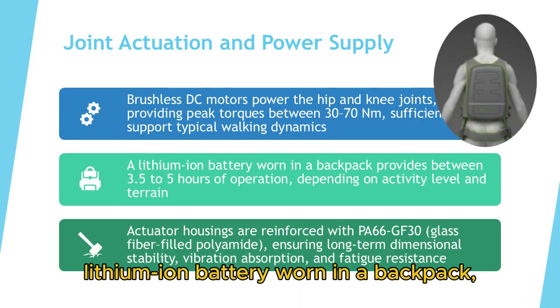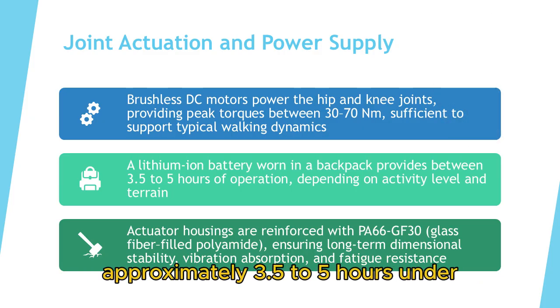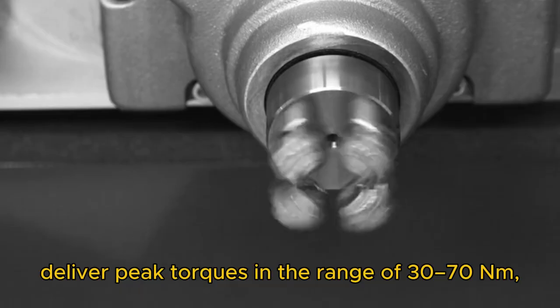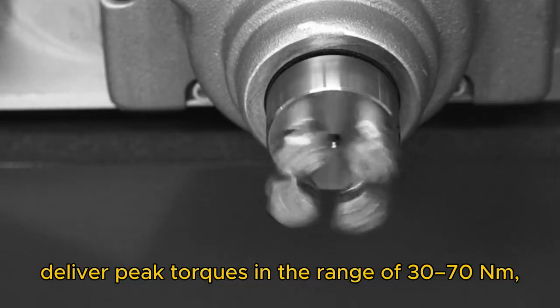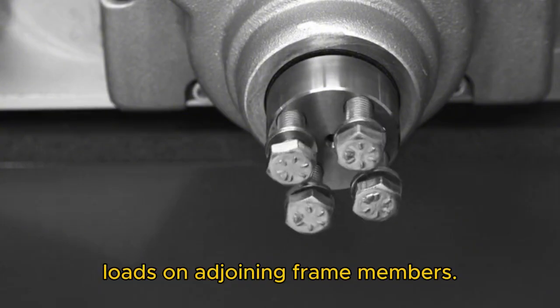Power is supplied by a lithium-ion battery worn in a backpack, with an operational duration of approximately 3.5 to 5 hours under typical usage conditions. The hip and knee joints, actuated by brushless DC motors, deliver peak torques in the range of 30 to 70 Newton-meters, imposing cyclical bending and shear loads on adjoining frame members.